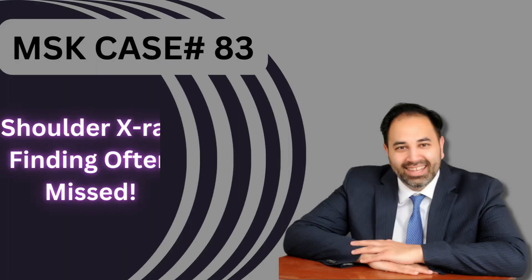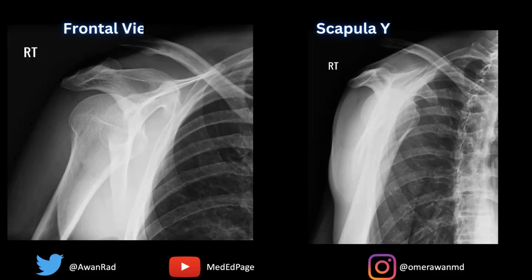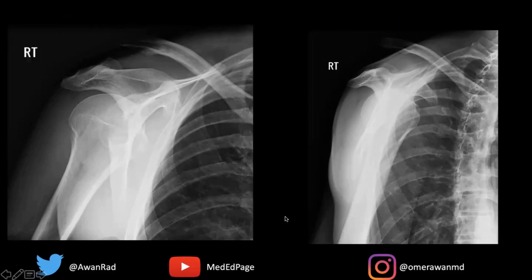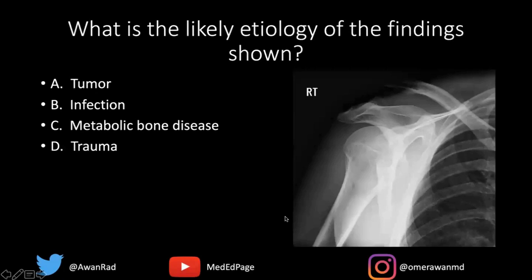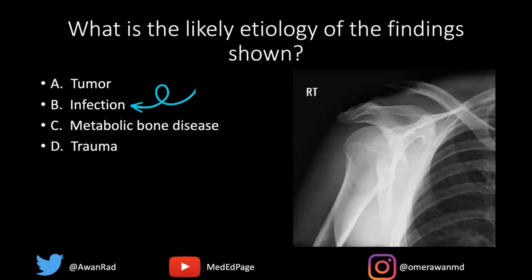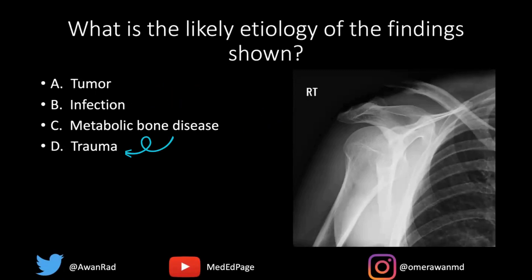Hello, everyone, and welcome to MSK Unknown Case Number 83. Here we have a frontal and a scapular wide view of the right shoulder. The question is, what's the likely etiology of the findings shown? Is this a quality of tumor, infection, metabolic bone disease, or trauma?